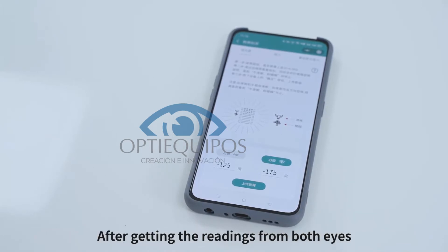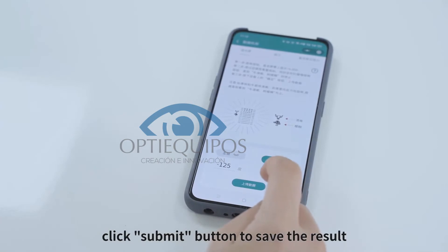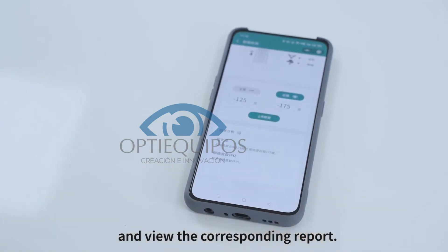After getting the readings from both eyes, click the Submit button to save the result and view the corresponding report.